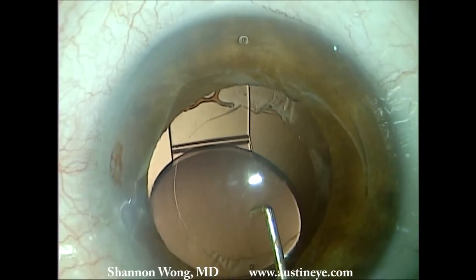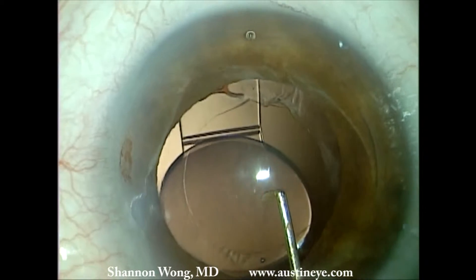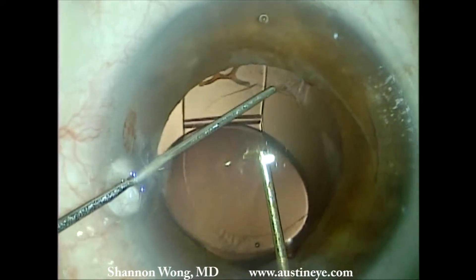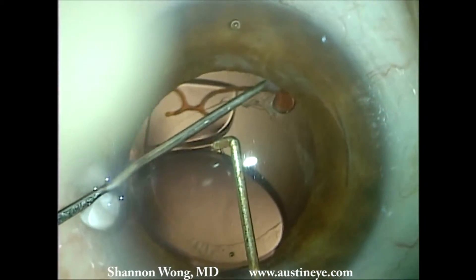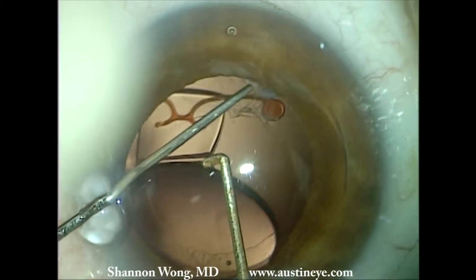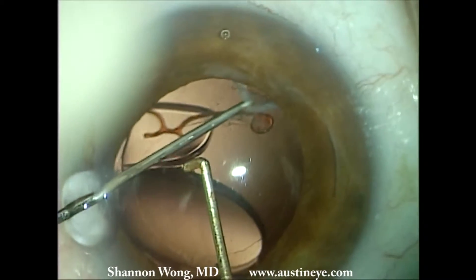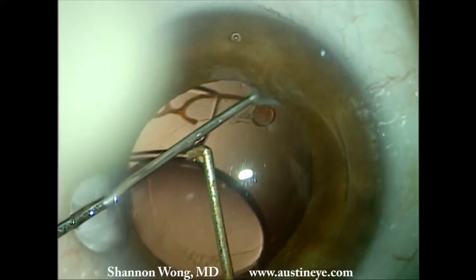Once we've vaulted the lens more anteriorly on the top screen, we discover that the haptic is fibrosed at the equator of the bag. We attempt to liberate the adhesion that has formed around the haptic but are unable to do so safely, as trying to separate this adhesion would likely cause a break in the capsular bag.